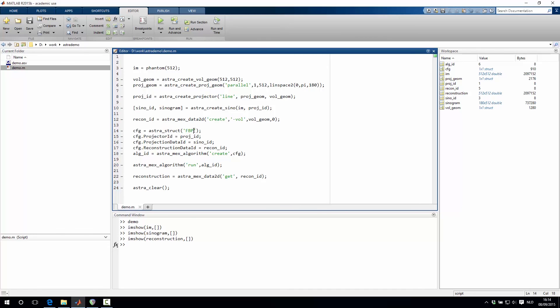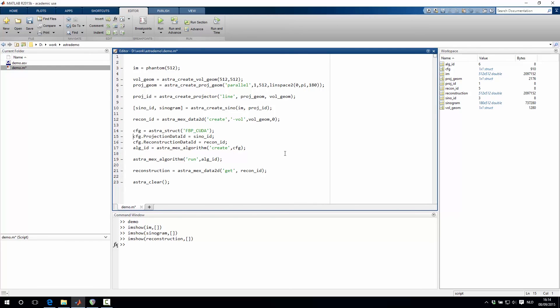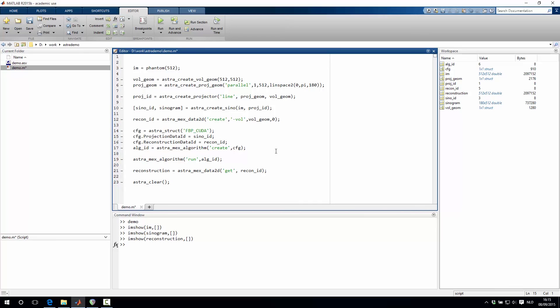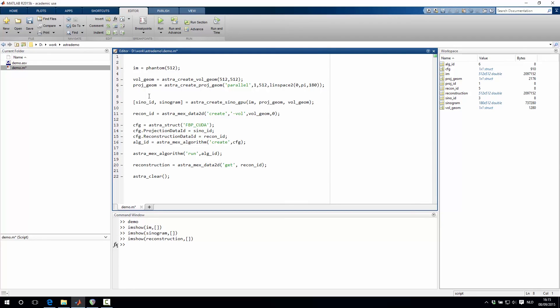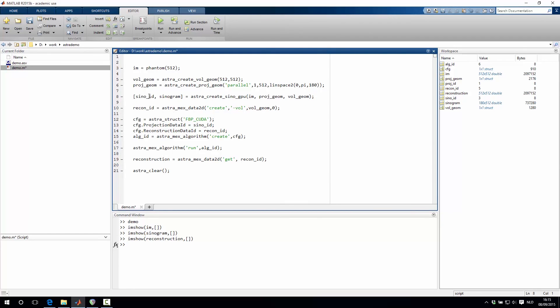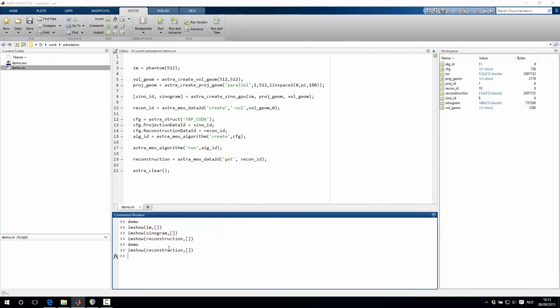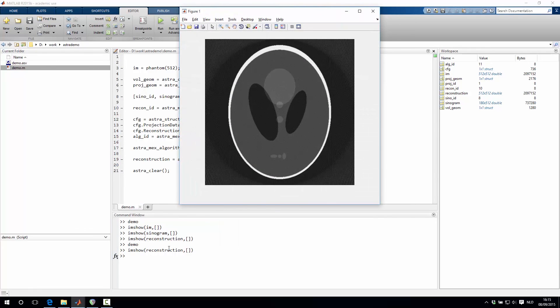Now to use this GPU accelerated version, we just have to add _CUDA to the name of the algorithm. And also we can delete the projector here because we have no need for that in the CUDA version. We then do have to change this function where we created the sinogram. And then we say astra_create_sinogram_GPU. And instead of the projector, we just specify the projection geometry and the volume geometry. We can then run this function again and again show you the reconstructed image.